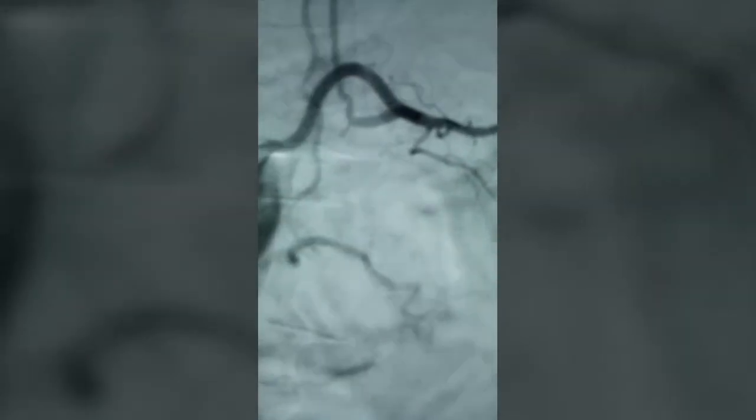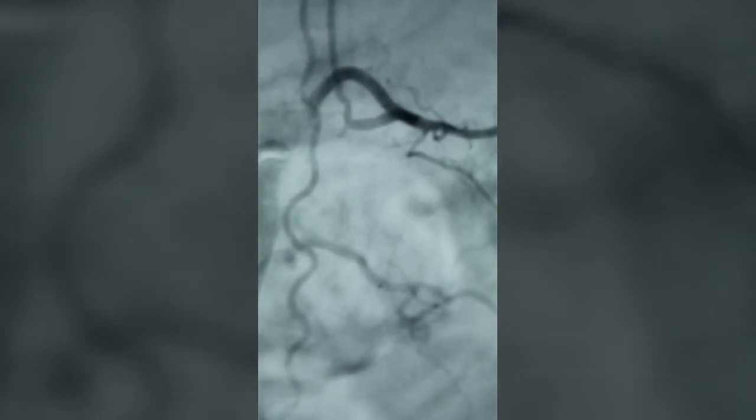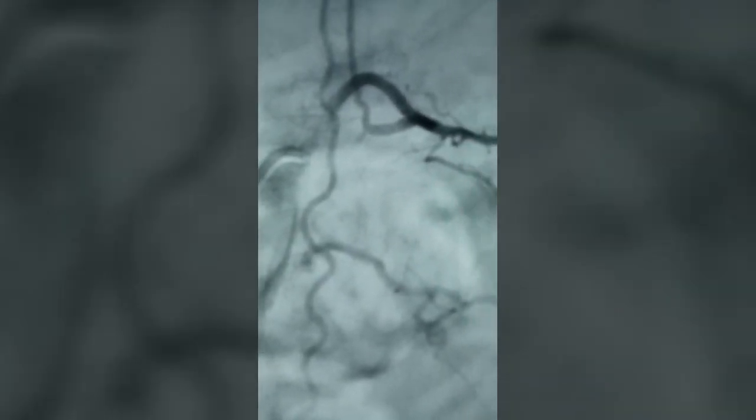And obviously once we do the check angio, we see that the fistula is no more filling at all. So that's a beautiful demonstration of a complete cure of filum terminale arteriovenous fistula. We can see that there is no flow whatsoever. This is the site of the glue, and we have given quite a forceful injection to see that there is no more fistula filling, and the glue cast is intactly seen.